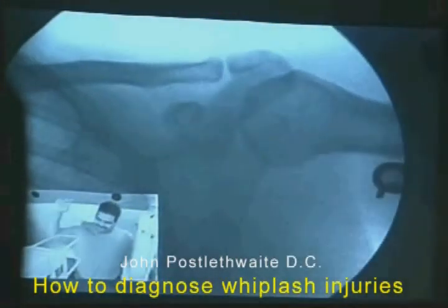Jose, let me freeze this. Jose went to the orthopedic surgeon. Guess how many MRIs? It's the gold standard, 5. They said, Jose, stand still, don't move, and they took an MRI, 5 negative MRIs. The treating doctor took 30 non-moving x-rays, all normal.